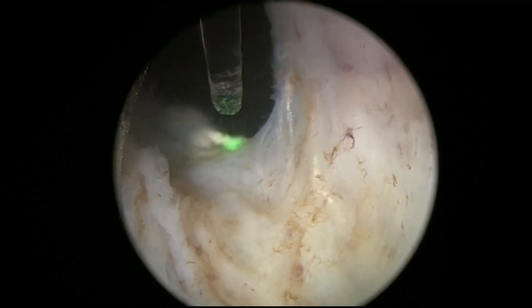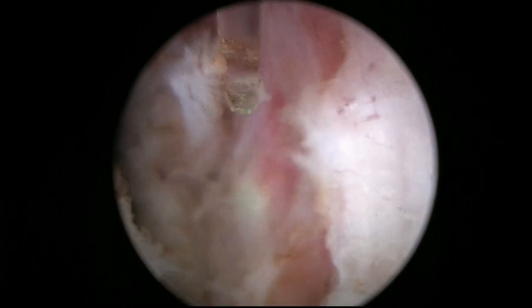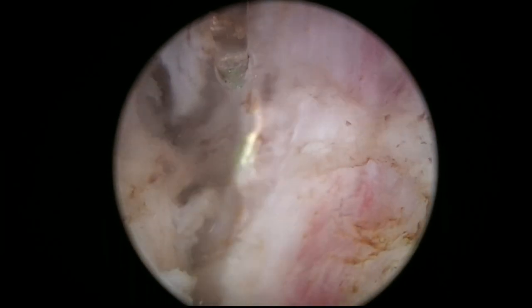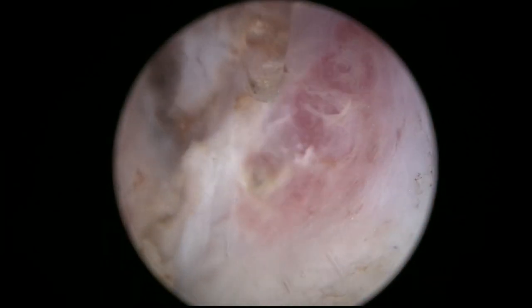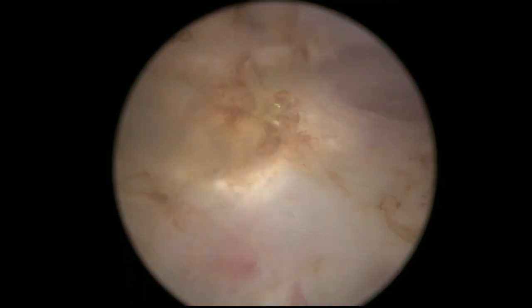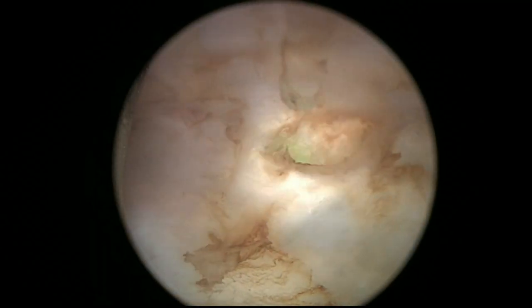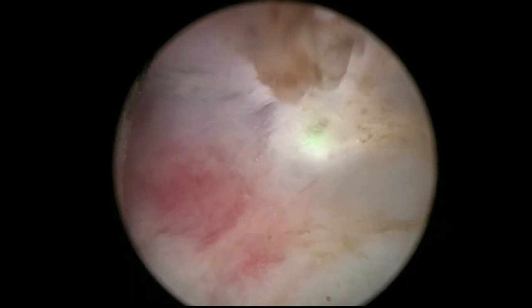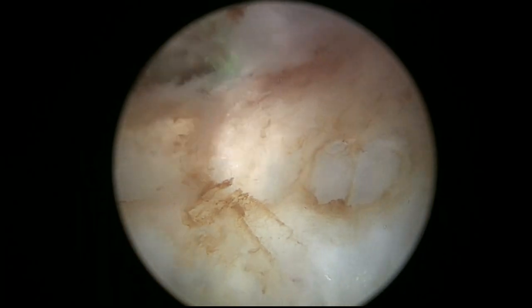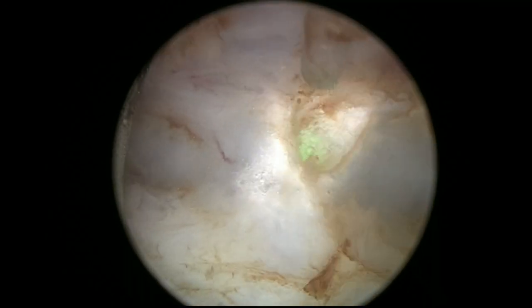With this laser, I can feel that the cutting properties are better than with Holmium. The hemostasis is equal or a little bit better. Of course, I'm quite happy with the hemostasis I get with Virtual Basket and Moses. The cutting here is more clean — one example is when you cut the mucosa in the bladder neck, you don't get so much bleeding. There's more hemostasis with this laser, less disruptive effect on the mucosa of the bladder, which can reduce the bleeding of the mucosa that might complicate morcellation at the end.